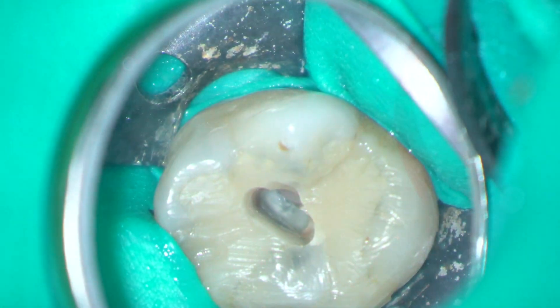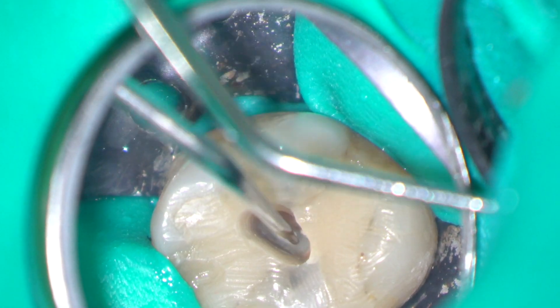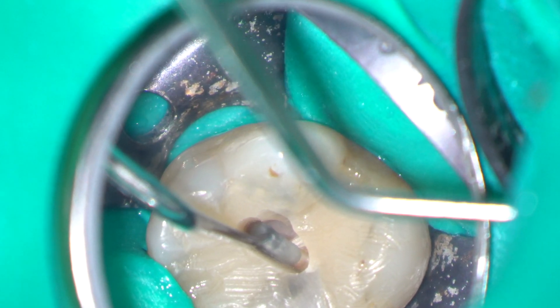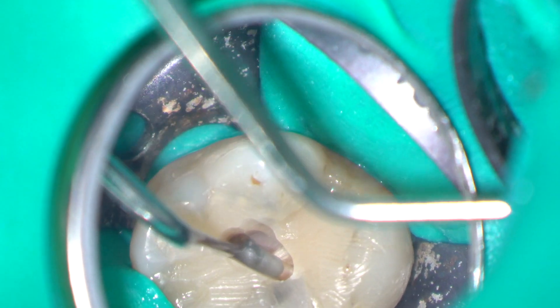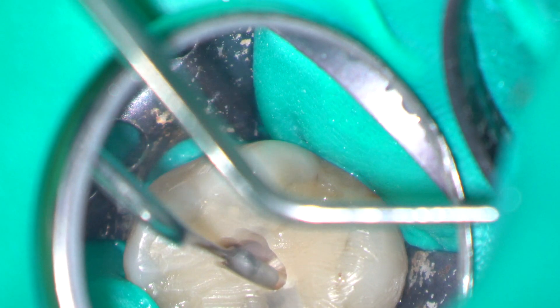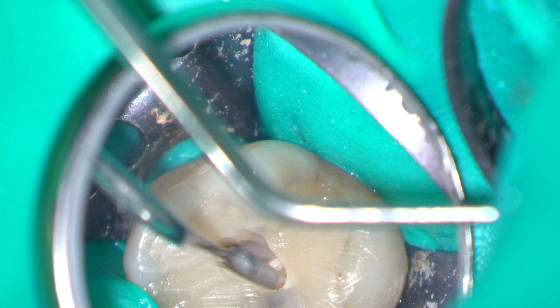Back in with that long tapered diamond burr and now I can see the floor of the pulp chamber. It's slightly darker. I'm examining it with the DG-16 endodontic probe.